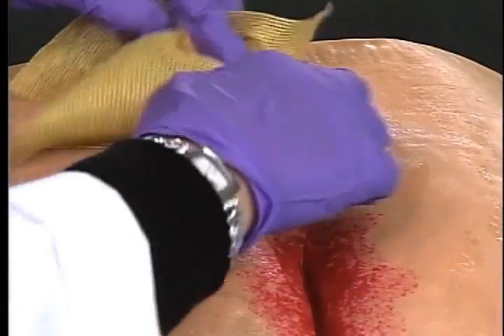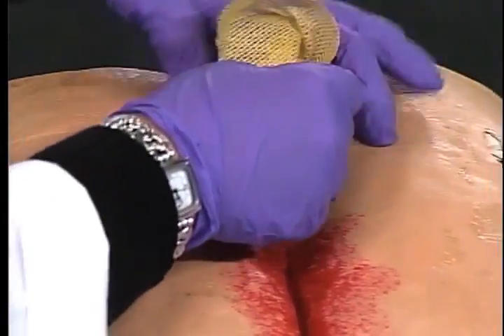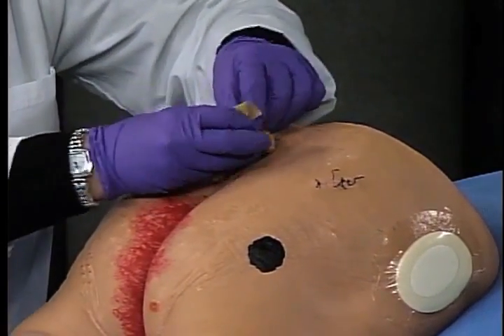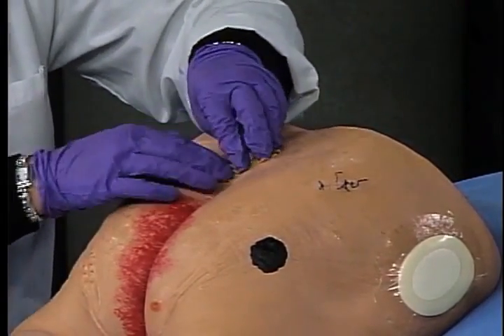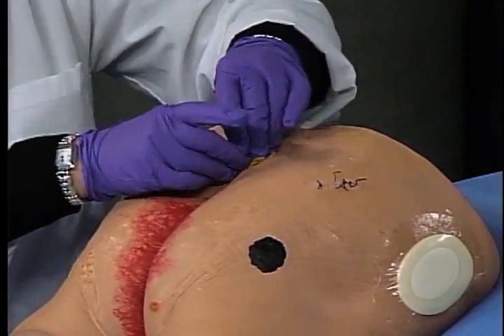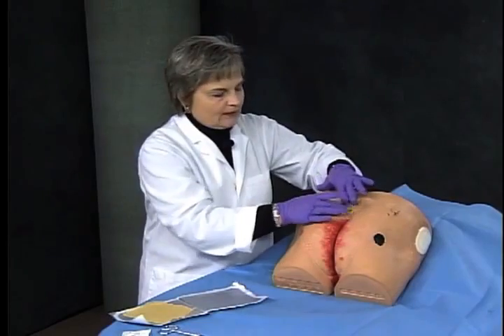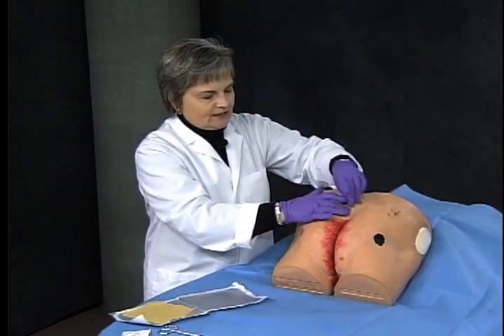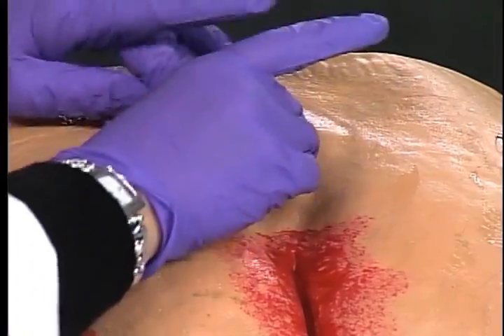You can kind of see the shelving around the edges of the wound. That's called undermining. We want to make sure that we tuck this silver dressing into all those areas of undermining. Now we're going to just gently fluff it down into the wound. For example, if you see that I have a little bit of a bulge here, I could have even trimmed some of this dressing off in order to make it more low profile before I put my cover dressing on. You don't want a big bulge of dressing when you're finished, but if this dressing was moistened as I put it in, then it would actually be a little bit flatter.